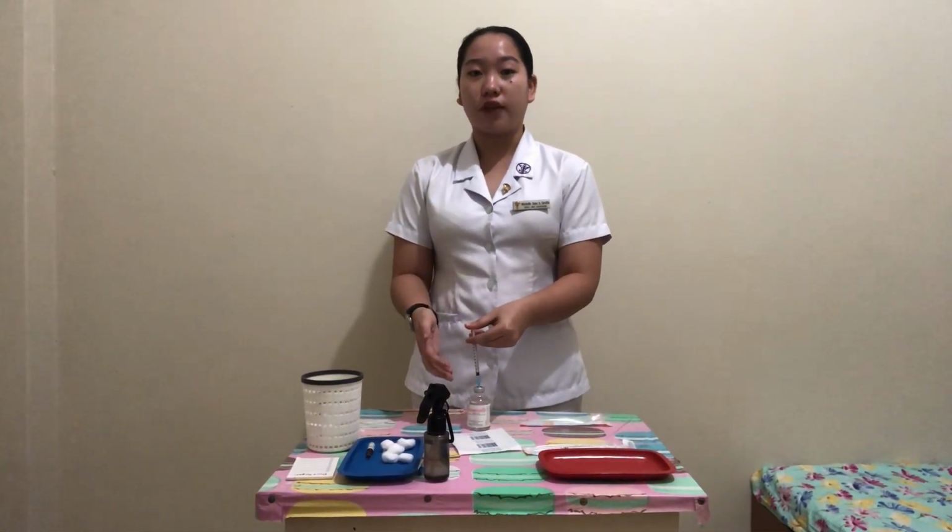So injecting air will allow the medication to be drawn out easily because negative pressure will not be created inside the vial. Now invert the vial and draw the medication up to the exact amount of the medication needed, and then hold the syringe and vial at eye level to determine that the correct dosage of the drug is drawn into the syringe.